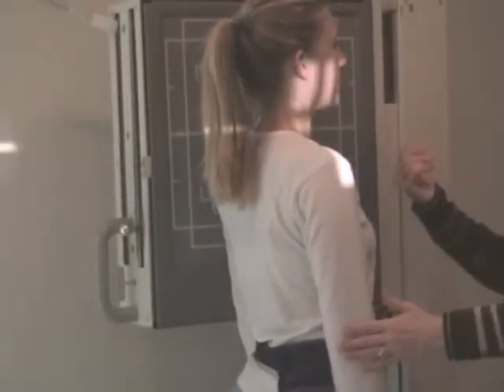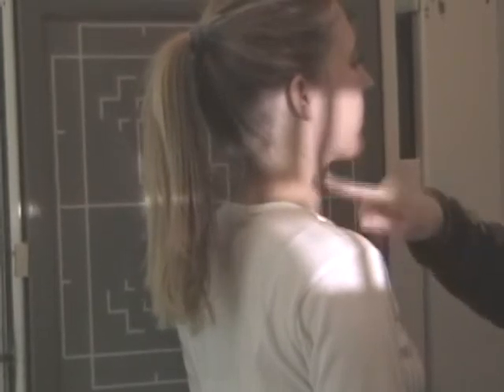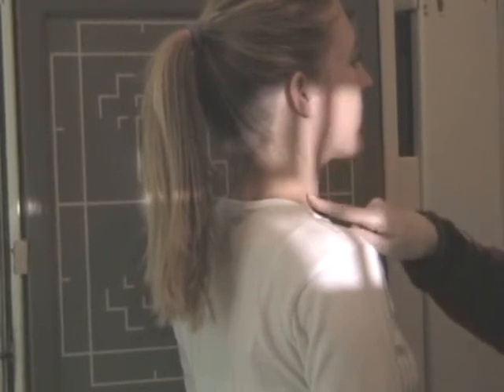And have your patient step forward until the mid-coronal plane, a little bit more please, is right to the center of the film. See, this crosshair is coming right down the center of her neck, just anterior to the EAM. That will be a good indication for you.